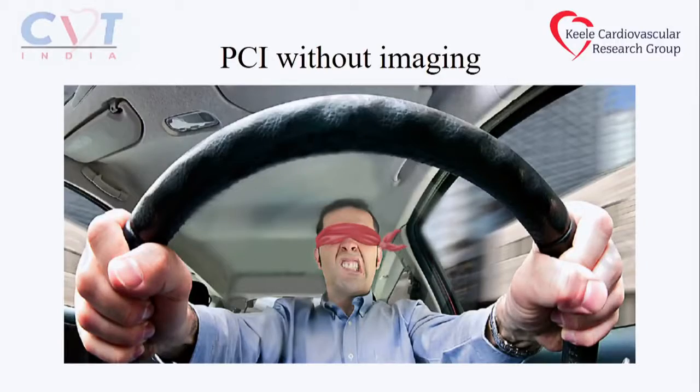And I think that's a really important take home, that IVUS or OCT is not just used for optimizing your PCI result, but also helping you make the decision of when not to stent in ACS cases. So doing PCI without imaging, in my view, is similar to driving with a blindfold on. You can't really always have a good result when you do this.